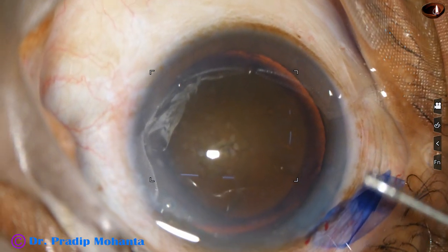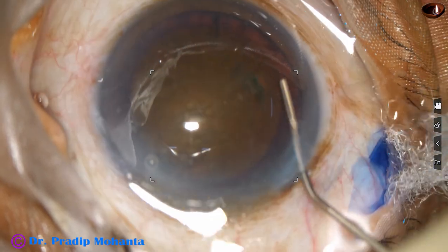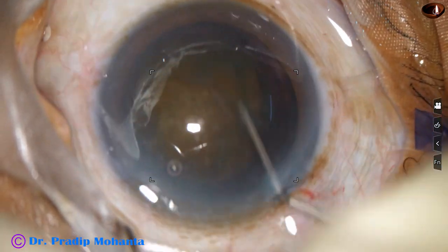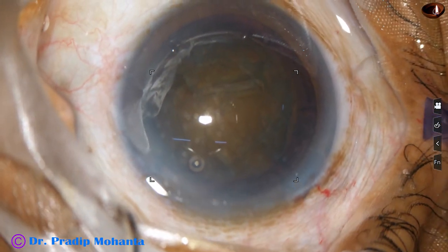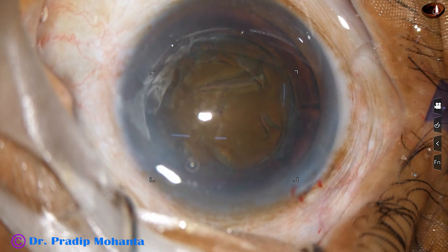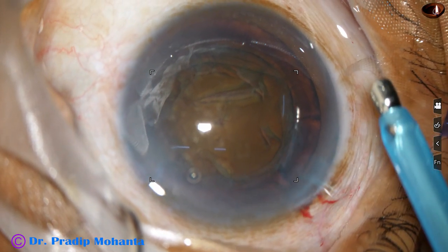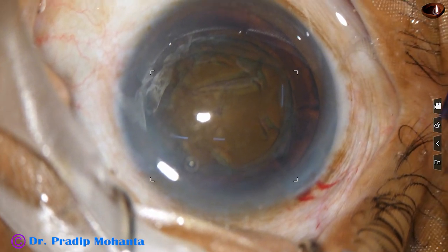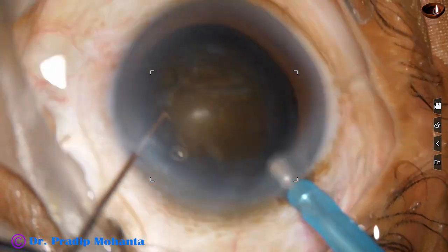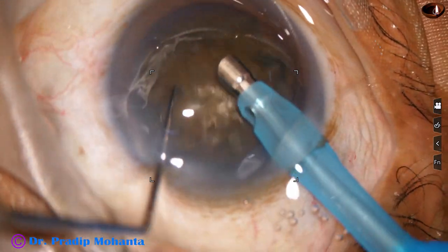Now, hydrodissection. BSS and a 27 gauge cannula is being used for hydrodissection. The nucleus is rotated. Again, some visco to fill up the anterior chamber. And now is the time to introduce the tip of the phaco needle. The tip has been exposed a little more than in other routine cases because I want to deliver more ultrasonic energy into the substance of the nucleus.